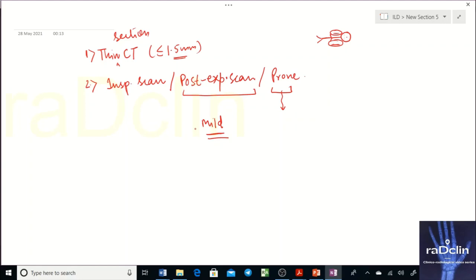If you are trying to pick disease at an early stage — which may present with mild reticulations — the atelectatic posterior lung from supine positioning can mimic disease. That's why we do the prone scan: if the density disappears on prone, it was positional; if it remains, it's true disease. The prone scan is good to pick mild, early disease.